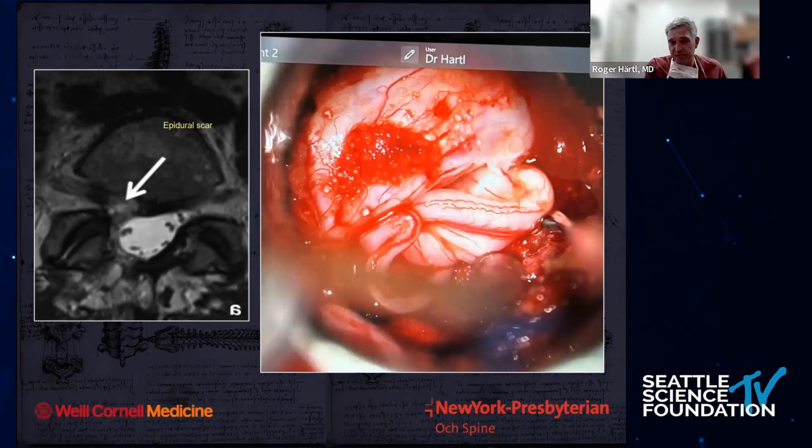There's a different case, a patient maybe a year ago or so where somebody took a picture intra-op from the microscope. This is a patient with previous surgery. I went back, I did a TLIF in this patient, and ended up with this leak. However, even these leaks, I fixed this through a tube with direct closure, and you can fix those, but obviously it's something that you would rather avoid.